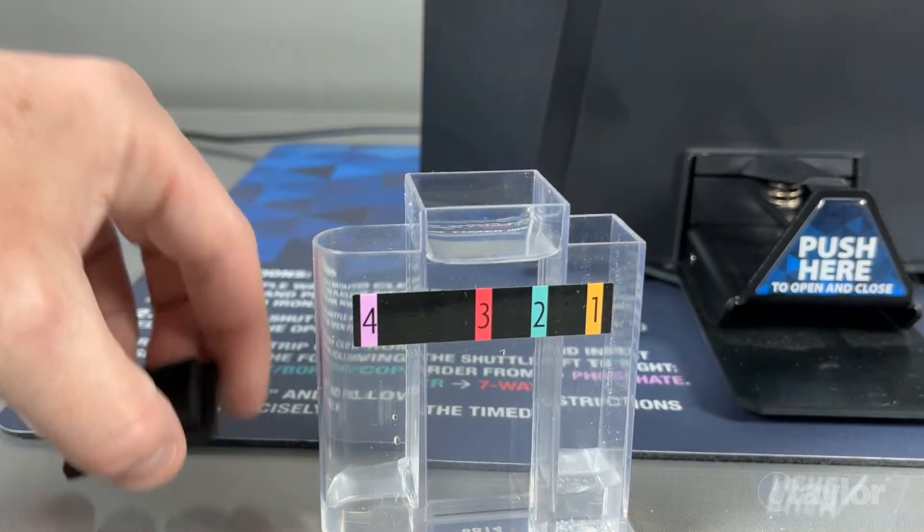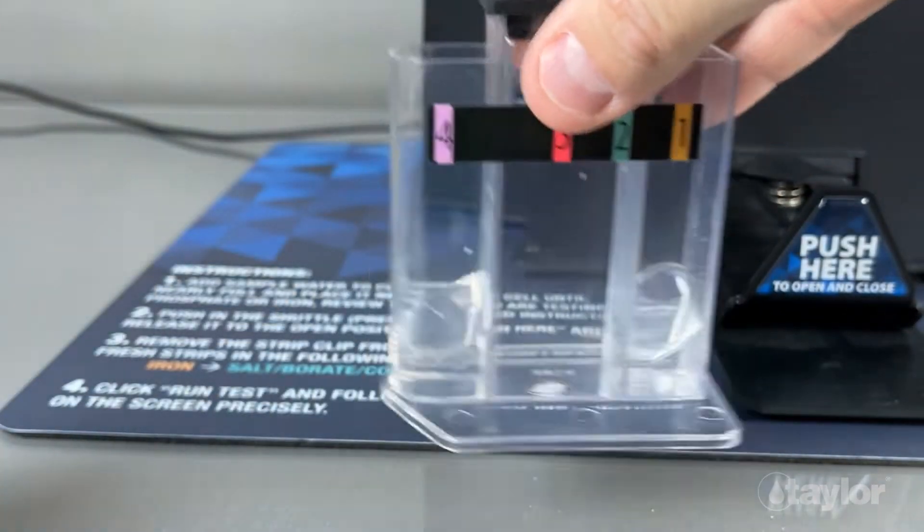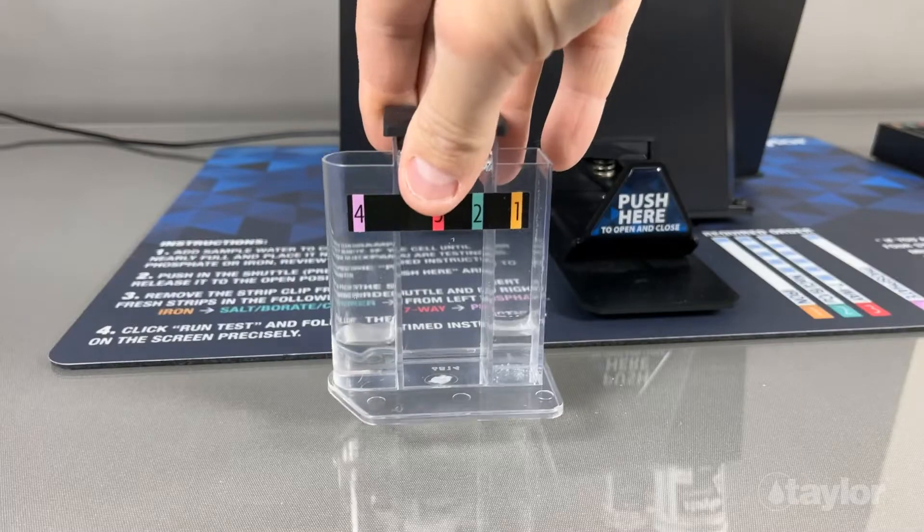Cap the vial to mix the reagents, then remove the cap.